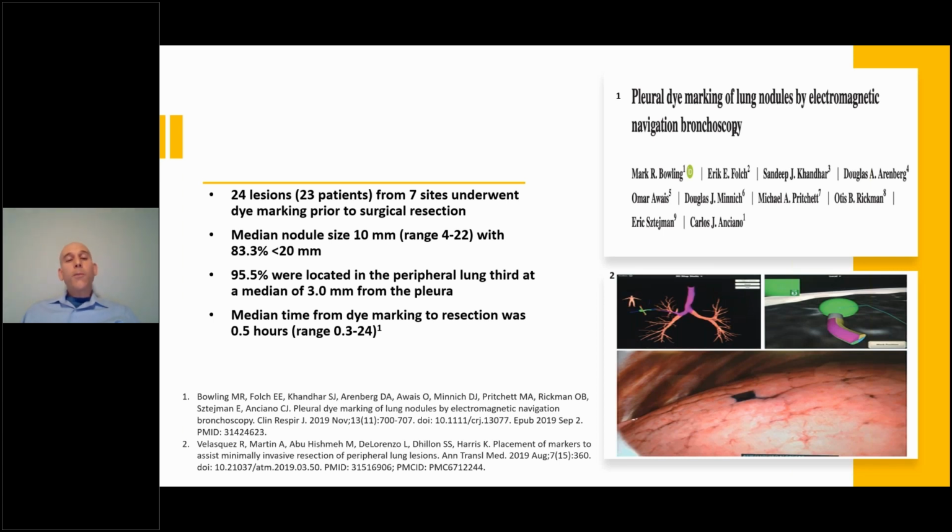So a couple of points to bring up here: only 24 lesions were dye marked, and if we look at the literature in more detail, there were likely many more that were eligible. So there are barriers to doing this procedure, to doing a marking procedure.